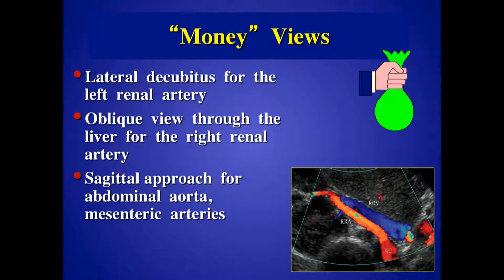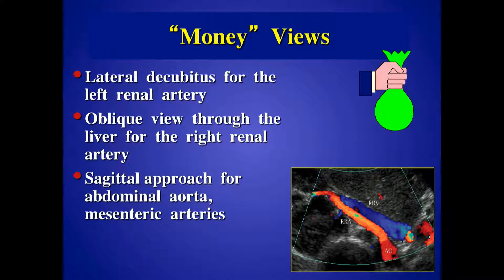If you optimize the color Doppler and you see a nice homogeneous pattern, you know there's no stenosis, but that requires adjusting your color gain or your PRF so that you would see a stenosis. Here again, renal vein and renal artery are very well seen. For the left kidney, it's essentially just turning the patient left side up and using the kidney as your window — you're able to see it extremely well.